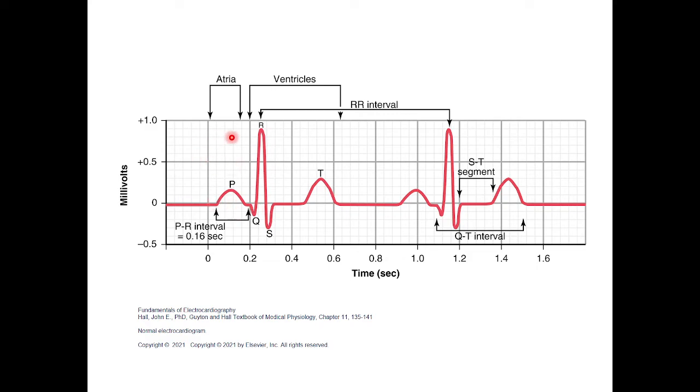That's why the ECG paper has so many squares, graded in order to calculate the duration of this interval. As we said, if this interval increases, it means there is a problem, a conduction defect. So by this we will find the abnormalities.